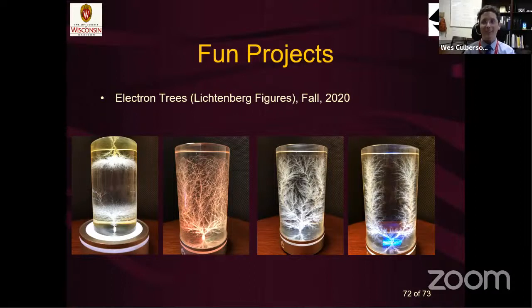So we irradiated these plastics, and then when you put a nail on these plastics, you walk in the room and you can kind of hear this sizzling and cracking. I'm not kidding at all. And you wear these insulating gloves, and you put a nail on the plastic and you tap it, and that nail is tied to ground. It'll go boom, it makes this flash of light, and it creates what are called electron trees. These are essentially all the electrons from that electron beam getting stuck in that plastic, and then they short right to that nail, and they do it so violently that they melt the plastic on the way, and it creates these beautiful electron trees. I don't know if you've seen these before. I've seen them. I've never made them before.